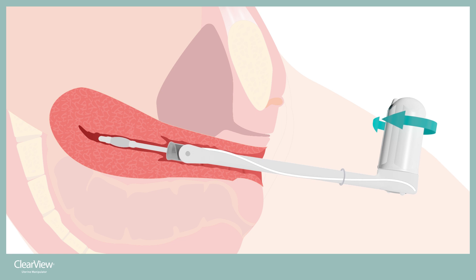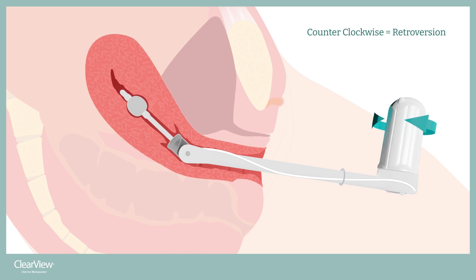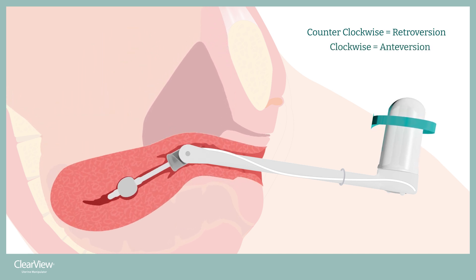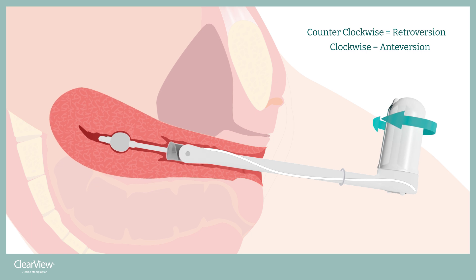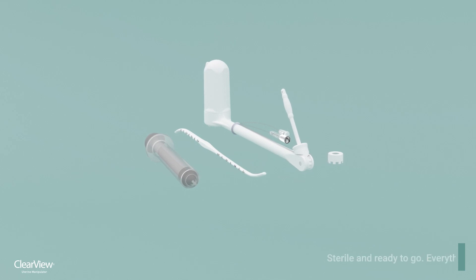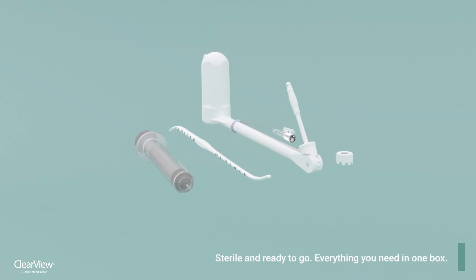The rotating control handle facilitates one-handed control, enabling the surgeon to manipulate the uterus without breaking the sterile barrier, putting complete uterine control in the hand of the surgeon. The ClearView is a self-holding device — its pivot at the cervical os, wide range of motion, and lightweight balanced design allows it to be set in place and left alone, freeing the hands of the surgeon and eliminating the need for an assistant.